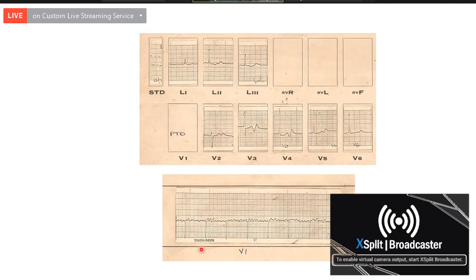The patient is having a complete heart block. Patient is having LVH. Patient is having prominent U waves. All put together, what will be your diagnosis? Patient may be in heart failure and on diuretics. Yes. So hypokalemia may be drug induced. Very good. One is hypokalemia, may be drug induced. Two.